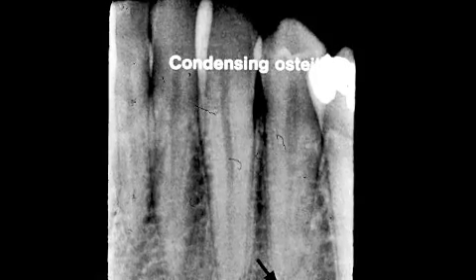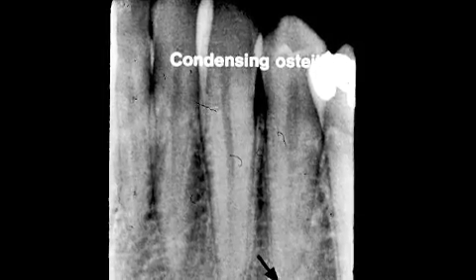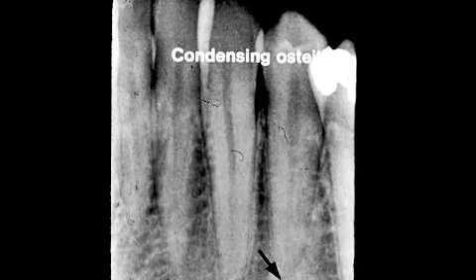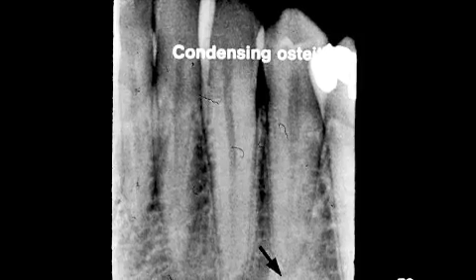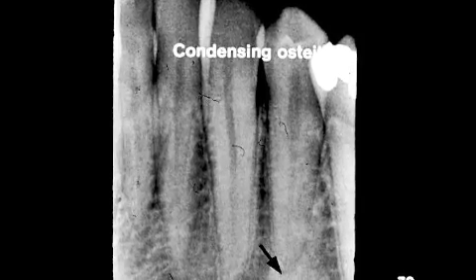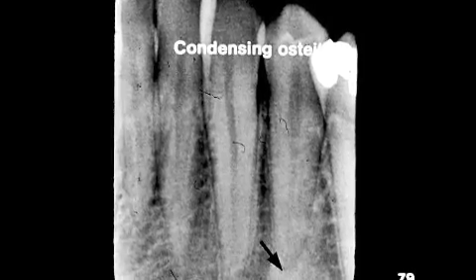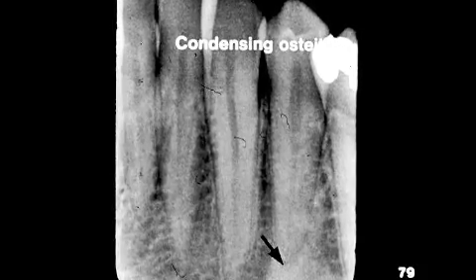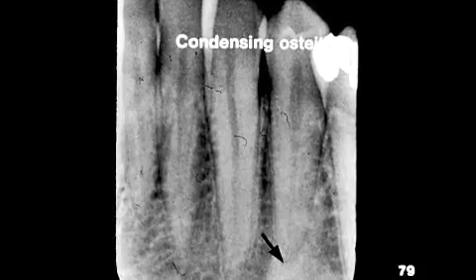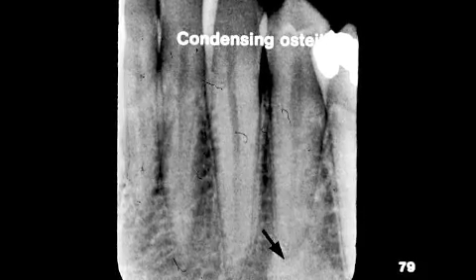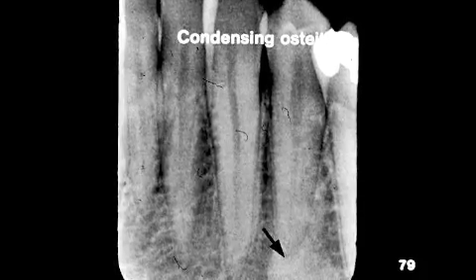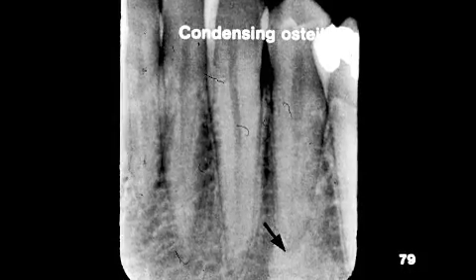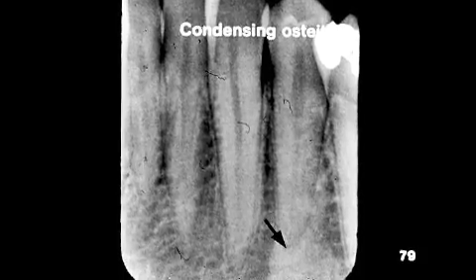Condensing osteitis is an opacity at the apex of the tooth. If we do a pulp test, we find that the tooth is non-vital. A similar opacity is known as sclerotic bone. Sclerotic bone can occur anywhere in the bone, but if it is at the apex of a tooth and we do a vitality test, the tooth is vital for sclerotic bone.